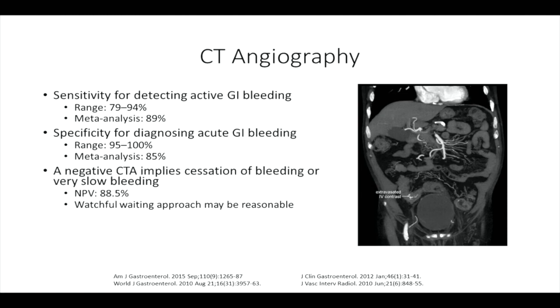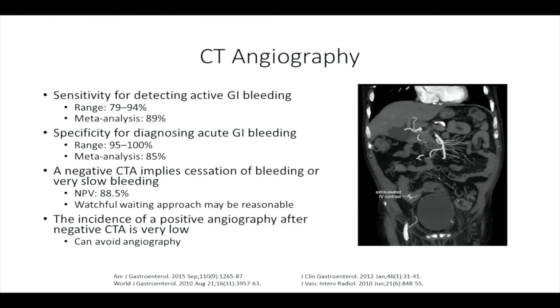A negative CT angio really implies either the cessation of bleeding or very slow bleeding, and has a negative predictive value of nearly 90%. And in these cases, with a negative CTA, a strategy of watchful waiting may be a reasonable approach. The reason for that is that the incidence of a positive angiography after a negative CTA is incredibly low. So you can spare some of these patients angiography.